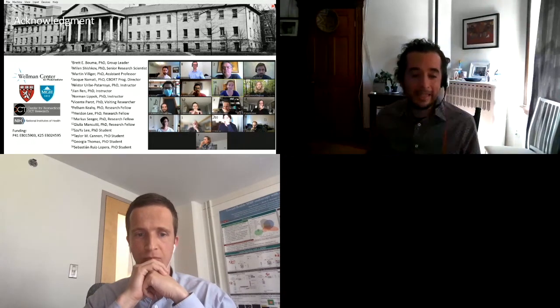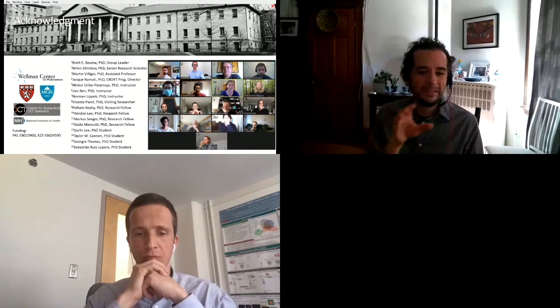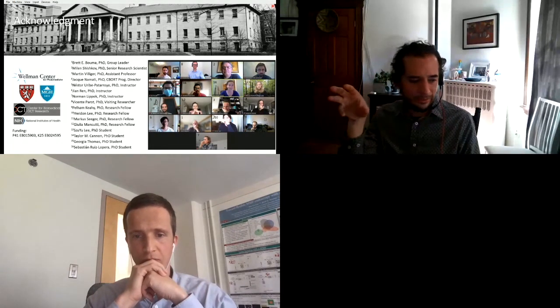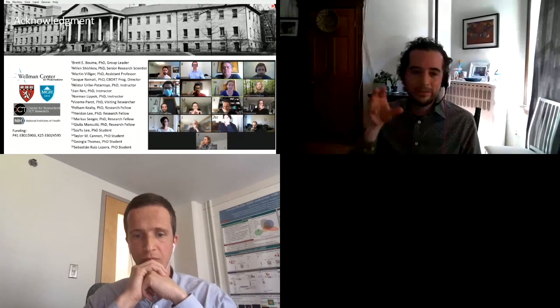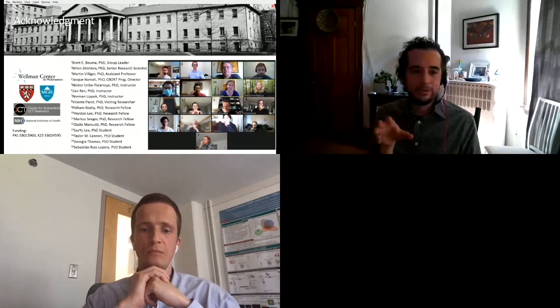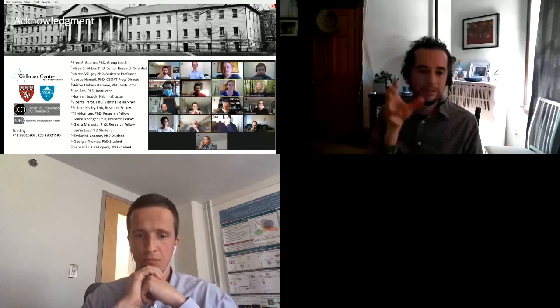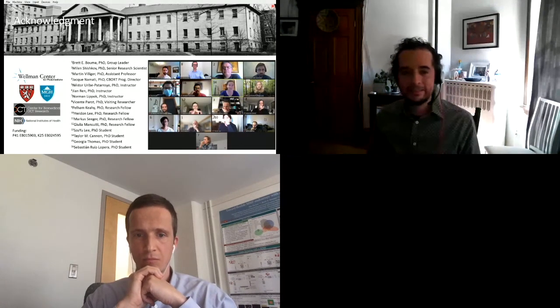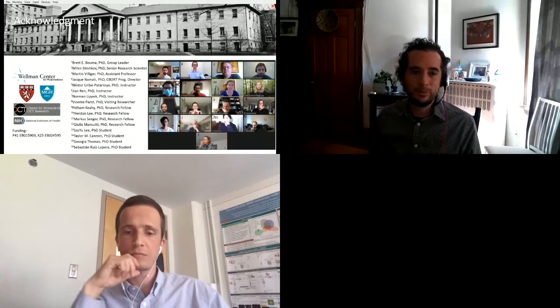I think that is a question that can be answered with simulations. But if we want to actually bring this into more realistic imaging, simulations are not great to capture many of these complicated issues in OCT, such as multiple scattering, for example. So I think that in that case, it would probably be good as a test bed, but not as the actual way to develop this.